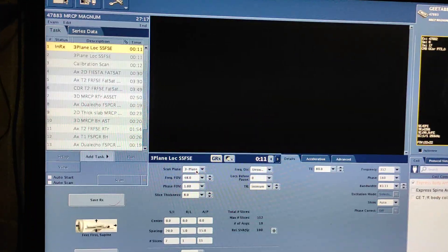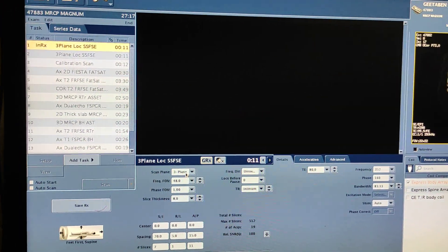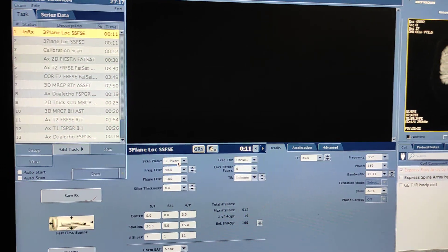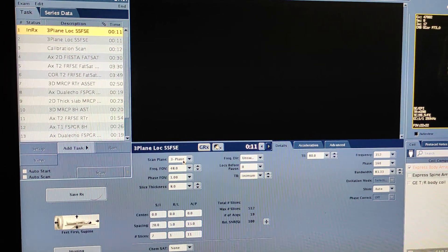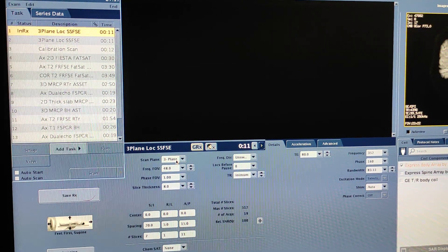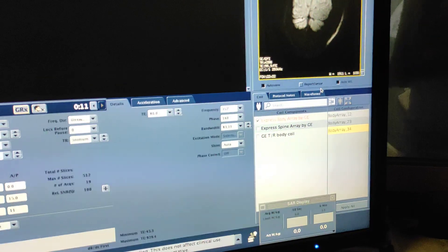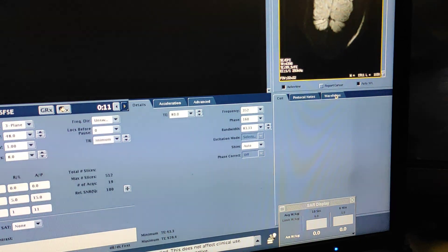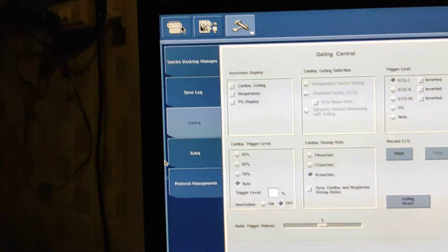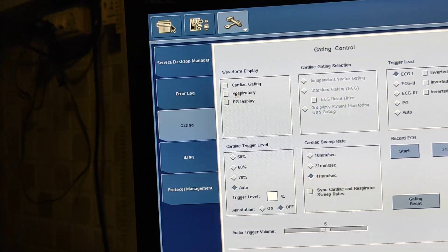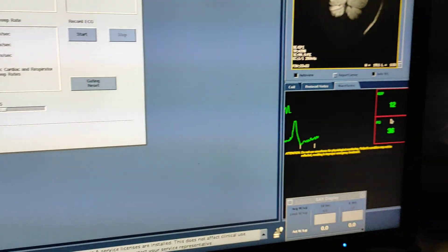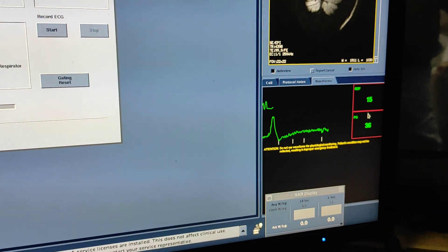First of all you have to take a three-plane localizer — in every scan you have to take a three-plane localizer, then only you can plan the sequences. From here you have to start the waveforms and select the respiratory and PG display. Here we will get the respiratory and PG display.